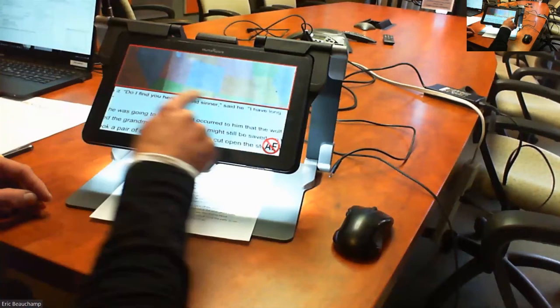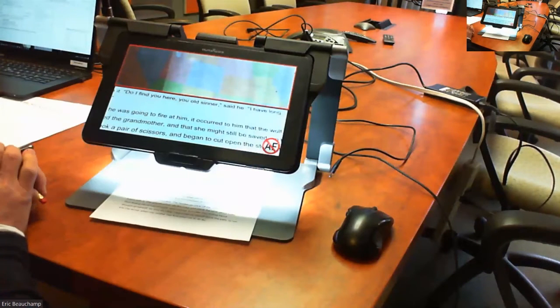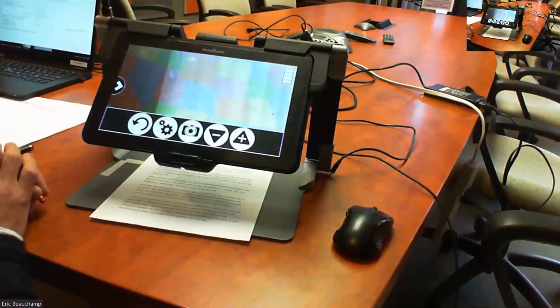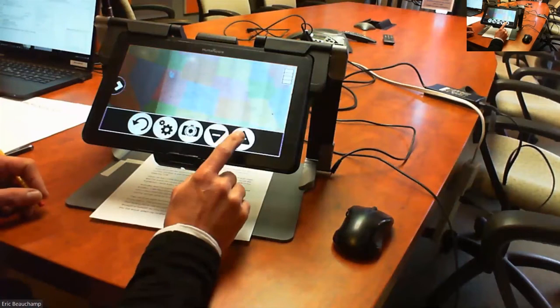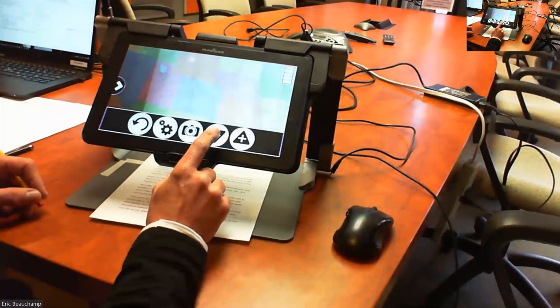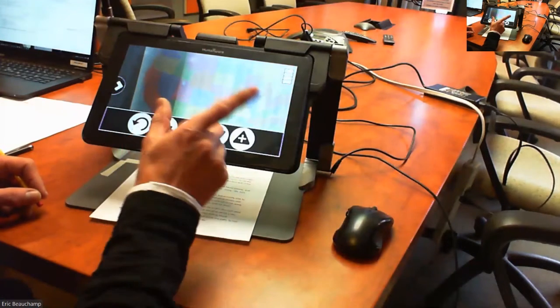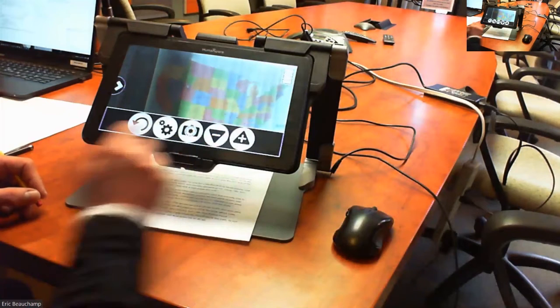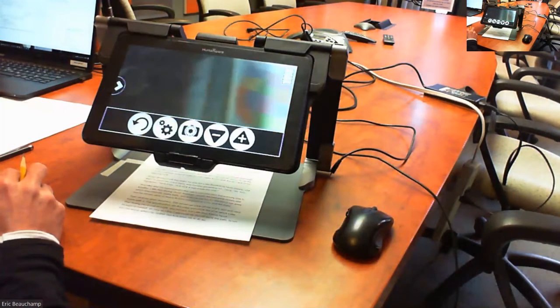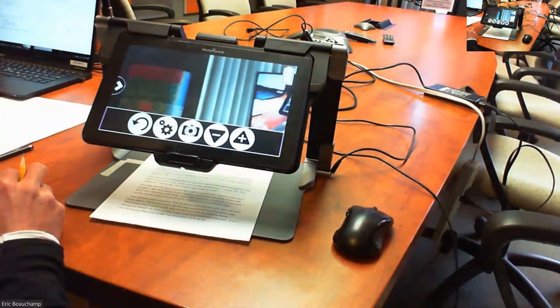Once that rectangle is on that distance application on top of the screen, tap on it. It's going to bring you to the distance application, and then press and hold on the plus button, and it's going to zoom in or zoom out gradually and a lot faster than the pinch and zoom. So that's why I like using these buttons. It's a bit quicker.